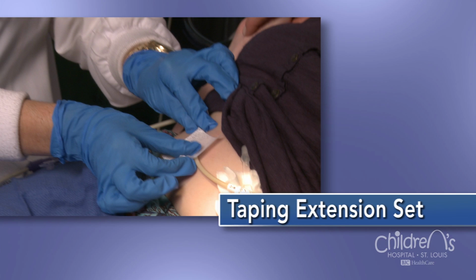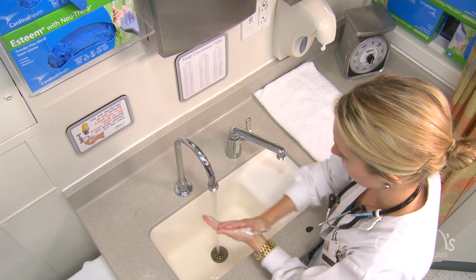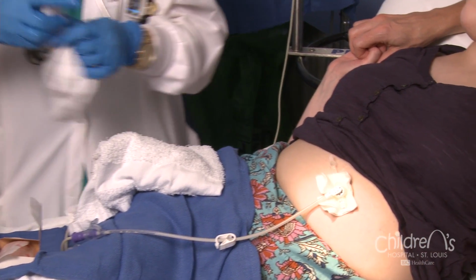In order to prevent pulling on the button during feedings, you'll need to tape down the extension set. Before you get started, assemble your supplies. You'll need scissors, skin wipes, also known as skin prep, soap, water, towel, and tape of your choosing. Once you've assembled your supplies, follow these steps. Wash your hands. Clean and dry the area on your child's abdomen where you will tape the extension set.